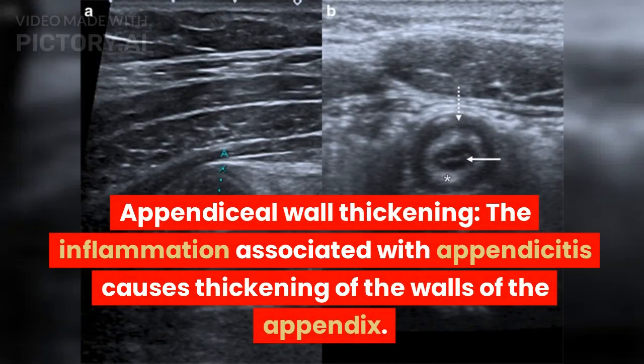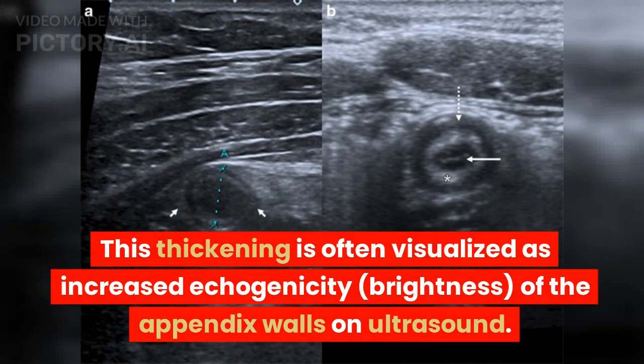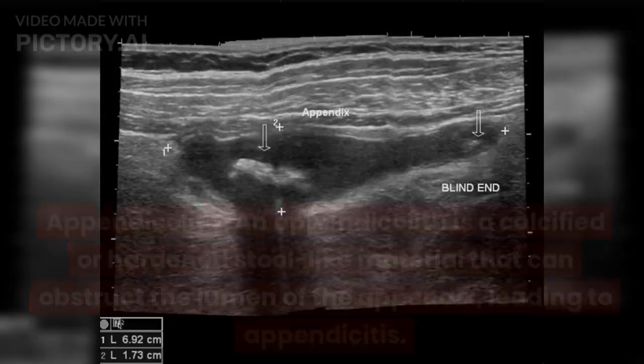Appendiceal wall thickening. The inflammation associated with appendicitis causes thickening of the walls of the appendix. This thickening is often visualized as increased echogenicity, brightness, of the appendix walls on ultrasound.